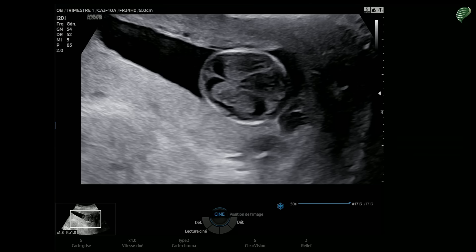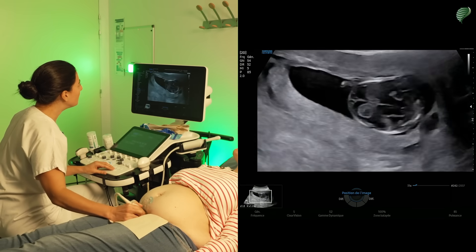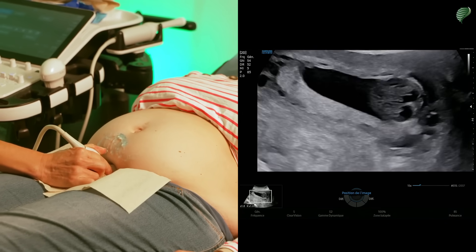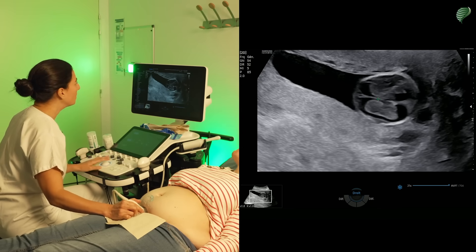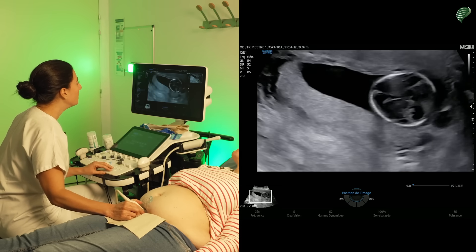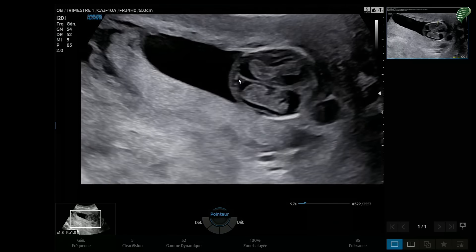I'm going to measure the biparietal diameter. To do so, I take this transverse image and try to align the midline as horizontally as possible. Here the midline is not perfectly horizontal, so I'll turn a little to align it more horizontally, putting myself in an optimal position for this measurement. I position my calipers to measure the biparietal diameter, which corresponds to the largest diameter I can measure. I also take the opportunity to explore the midline, which is continuous from back to front.